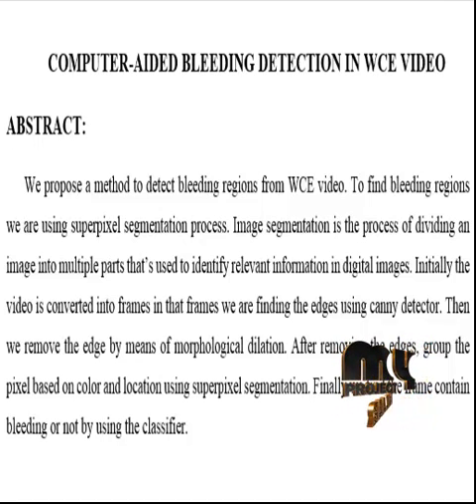Then finally, classification is employed using a support vector machine to identify whether the samples contain bleeding or not. For the classification, the features were extracted based on statistical parameters. Finally, the performance of the process was analyzed in terms of sensitivity, specificity, and accuracy.